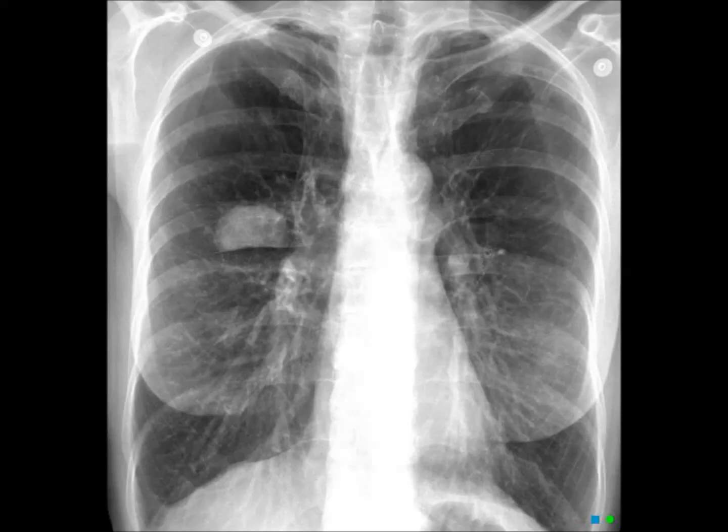Step 4: look at the big picture. When you're examining a patient, you observe the whole patient from the end of the bed before delving into small details — it's the same with examining imaging. Look at the whole thing. Can you immediately see any obvious abnormalities, like a large lung mass? Step 5: now we want to start looking at the details. The most commonly used system is the alphabetic approach — A, B, C, D, E, F, G, H, I — as it's easy to remember and you're unlikely to miss anything.